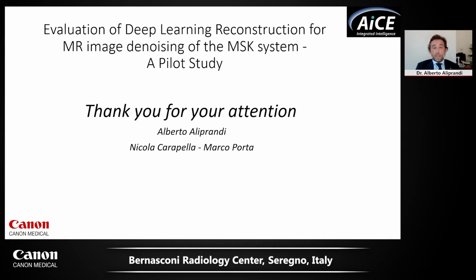It will grow, and as we move along with the evaluation, what we'll do next is twofold. Firstly, we want to evaluate AiCE further to see what it can deliver beyond clinical routine. For example, we are working on a 3D submillimetric isotropic sequence to replace the 3 perpendicular planes.